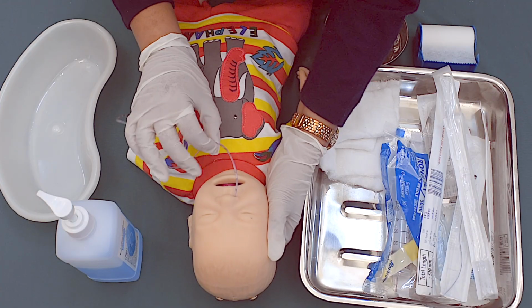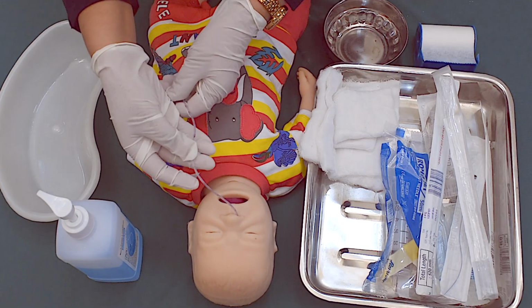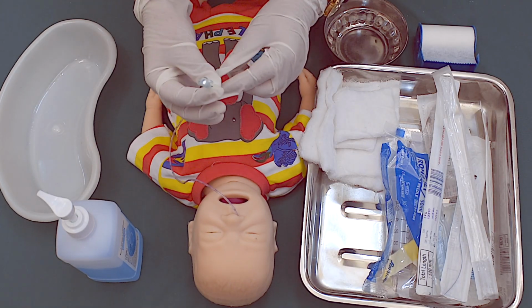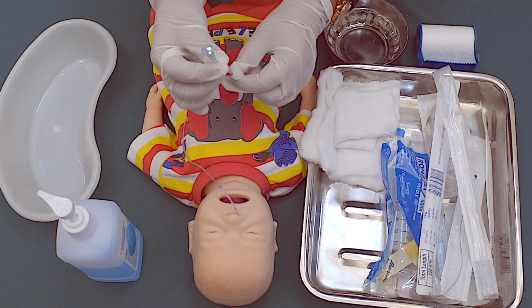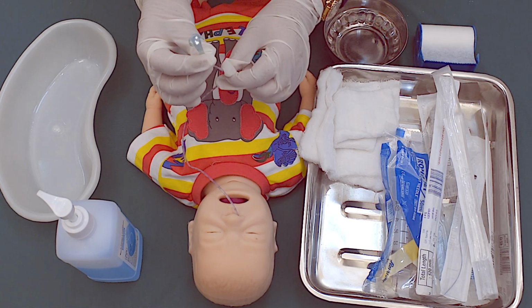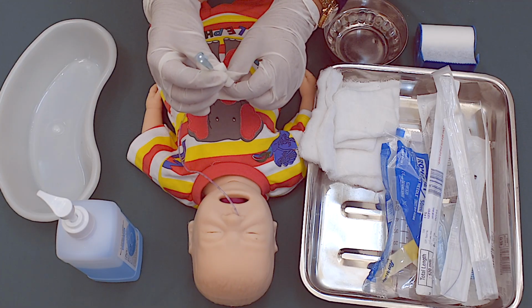Once the required length is inserted, the tube has to be checked for placement. There are three methods to check the placement of the tube, whether the tube is in the stomach or if it is in the trachea.